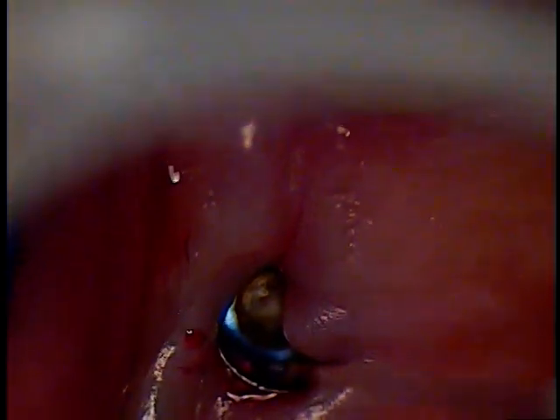What we'd like to do first is take the diode laser and just trim some of that tissue away. We'll just slowly go in there. Let's have a white surgical tip.